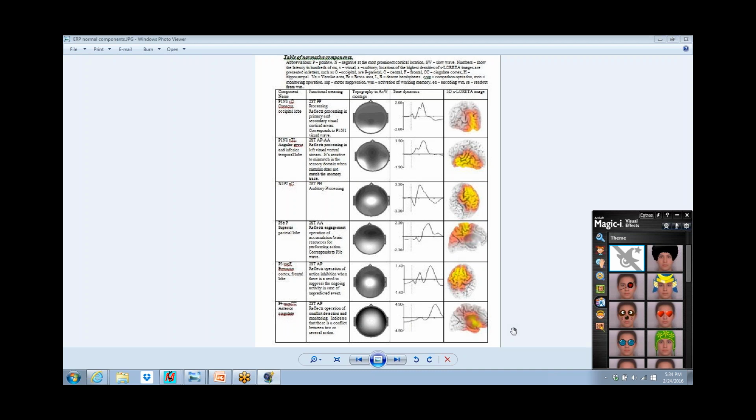Is there a neurofeedback application for something like that cingulate damage condition, where you can target the cingulate with feedback? Both. Traditionally people had done surface feedback, assuming that they were influencing the cingulate, and they got cingulate-related behavioral change, contingent change on the feedback. So if you're feeding back to get rid of the alpha at the anterior midline, the assumption was that that may be influencing the cingulate, and sure enough, getting rid of alpha at the anterior cingulate area on the surface, they got a contingent behavioral change.